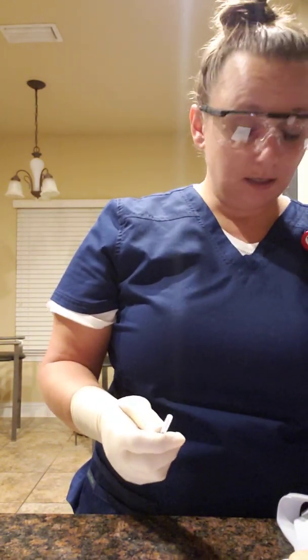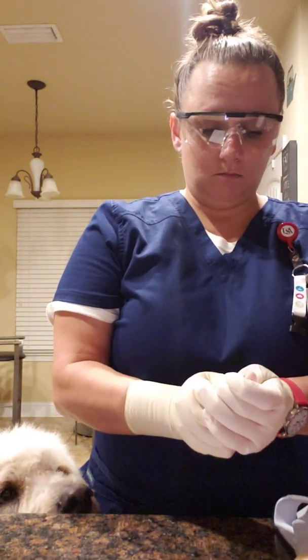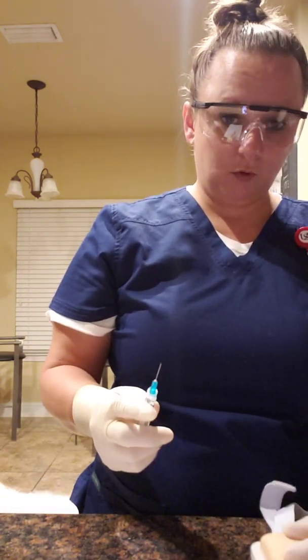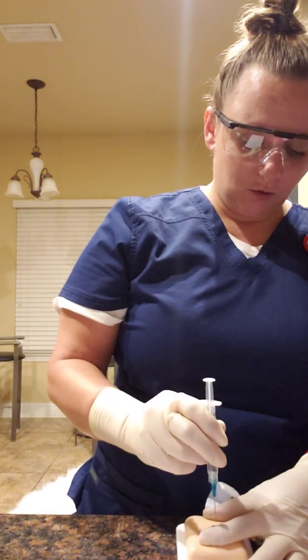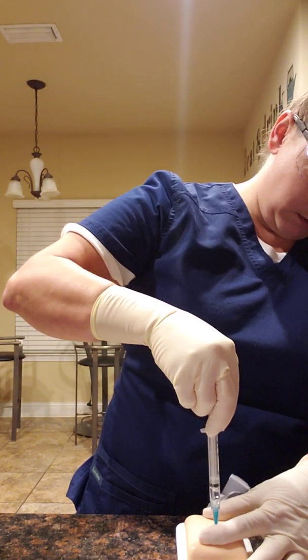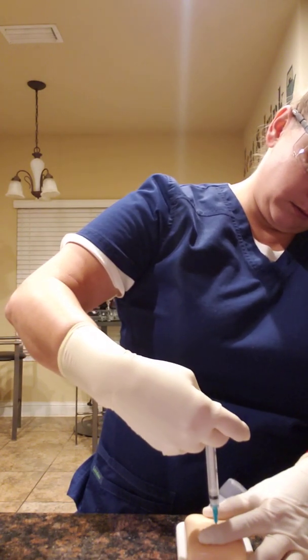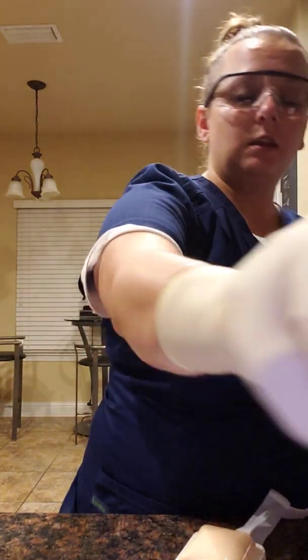So I'll locate the right injection area. Pull the skin back tight. Go in deep. All right, Mr. Jones, big stick. Then I would aspirate for blood. No blood. Then I would inject. Then put the needle in the sharps container.